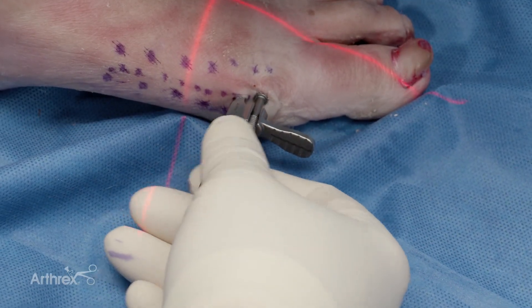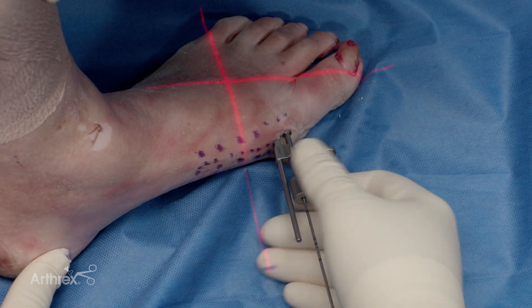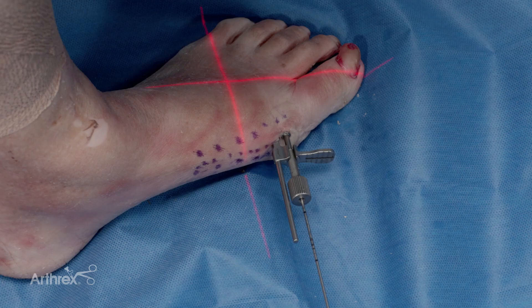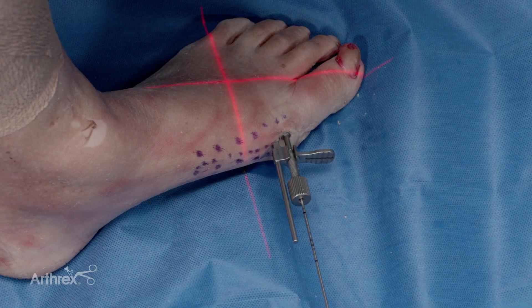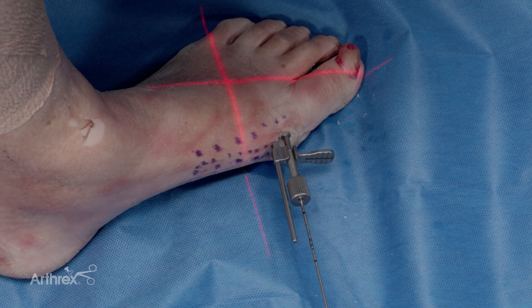If you're going to do this fairly quickly — within five to ten minutes — you don't need to make an extra cut for the paddle on the skin. However, if you're going to keep this on for a while, or if you're just starting out with MIS surgeries, then I'd probably make a small incision to prevent any necrosis of the skin.